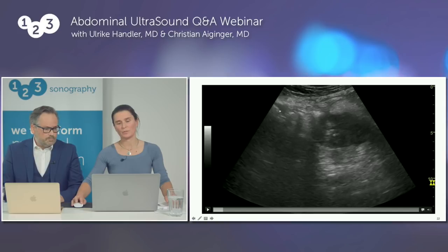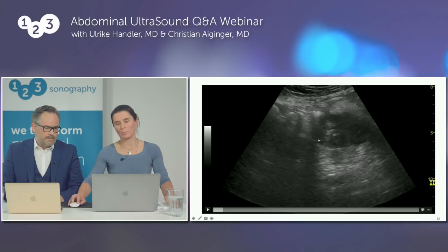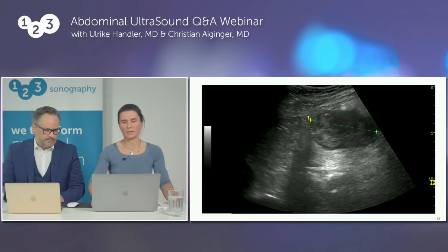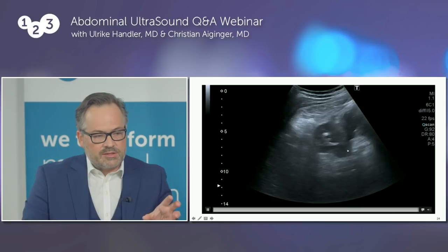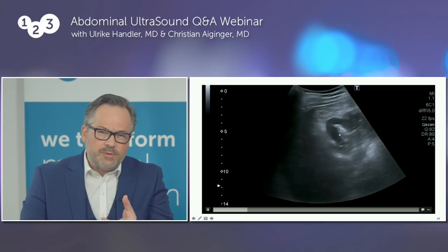Here is another example: the so-called 'pseudokidney sign.' The colon looks as if there's another kidney — you have a hypoechoic rim of tumor and inside there are hyperechoic reflexes of gas bubbles — making it look like a pseudokidney. The diameter here is more than five centimeters.